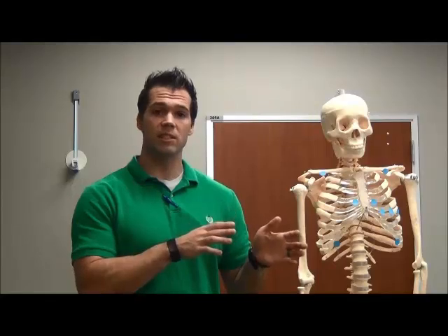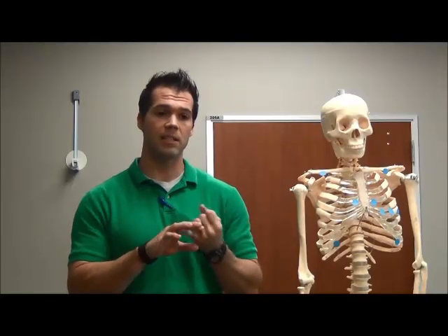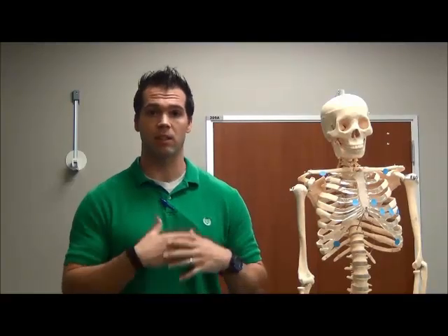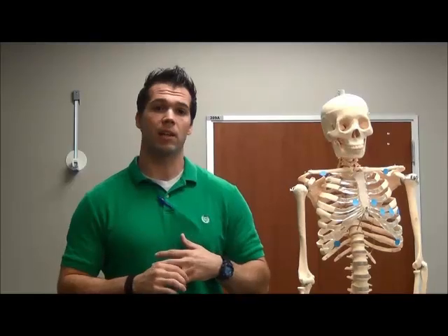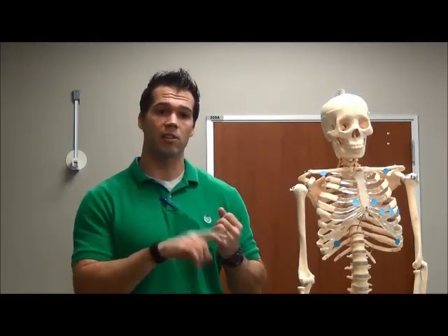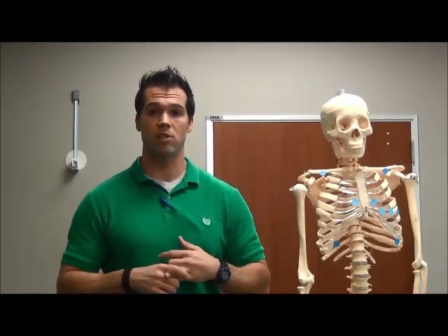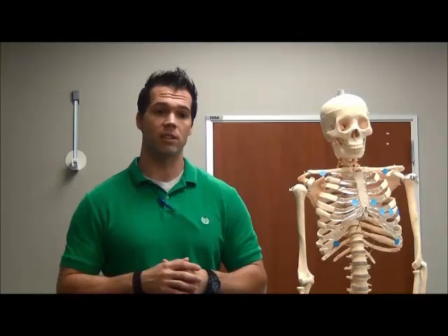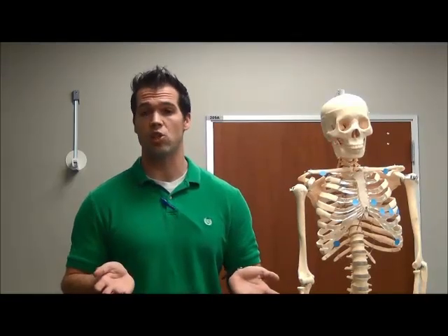You would do this type of measurement in any sort of clinical setting, if you want to be a clinical exercise physiologist, any laboratory setting, a lot of different doctor's offices, even places where they measure athletes' VO2 max will often hook an athlete up to an EKG to make sure that their heart is functioning the way that it should.